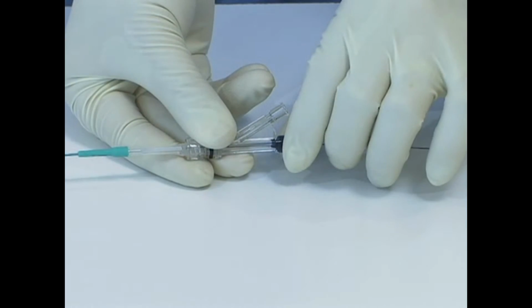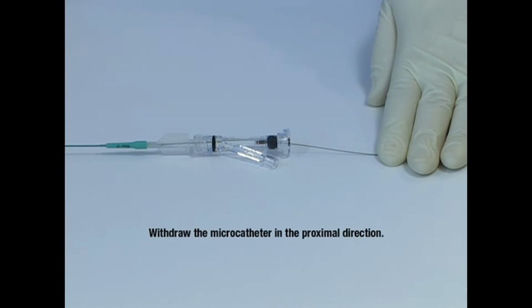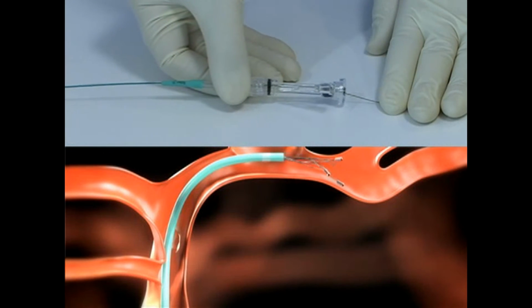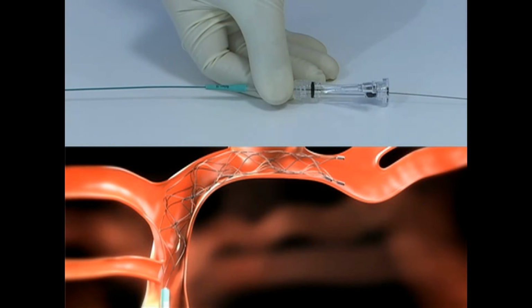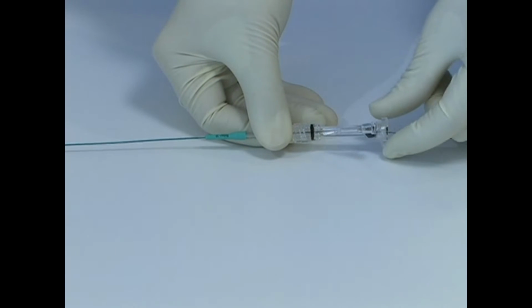To deploy the Solitaire AB, loosen the RHV, then carefully withdraw the microcatheter in the proximal direction. Retract the microcatheter to where the detachment zone is outside the microcatheter. Tighten the RHV to prevent any movement of the push wire.